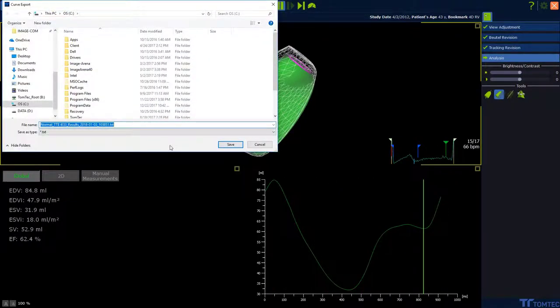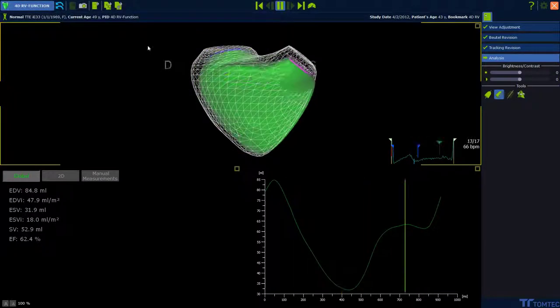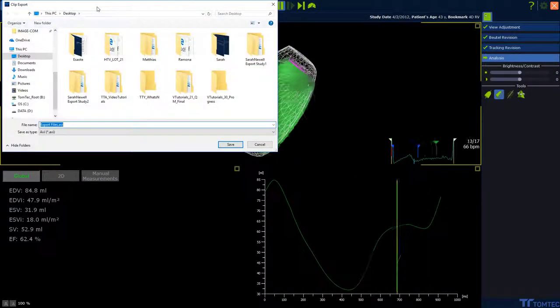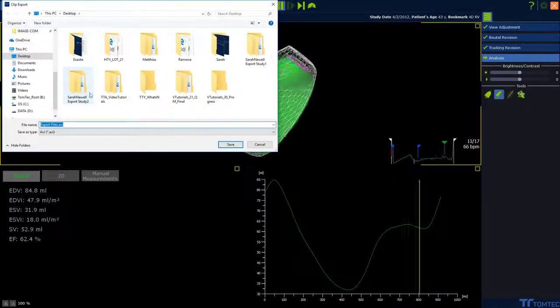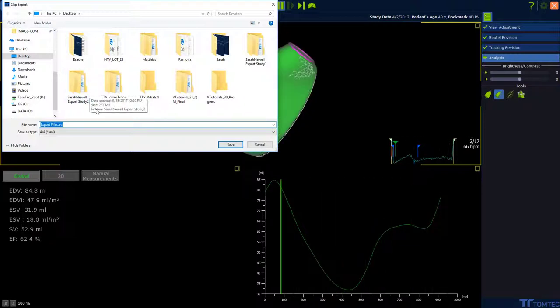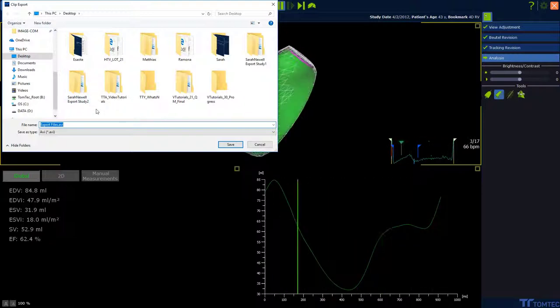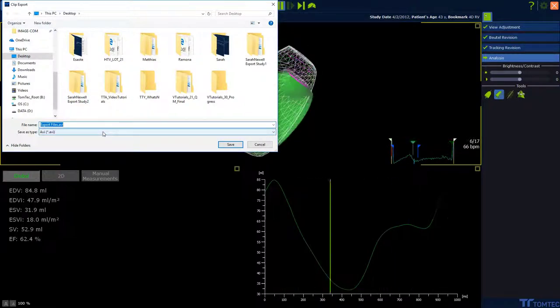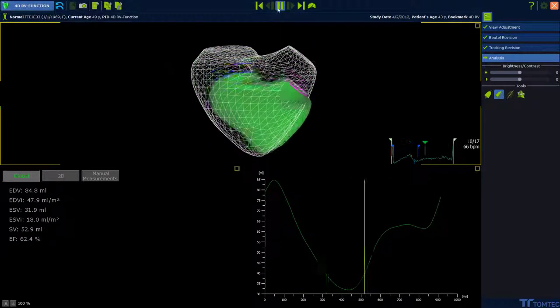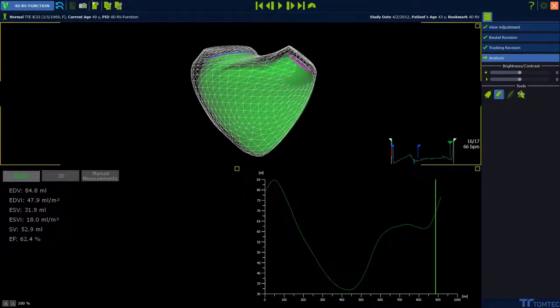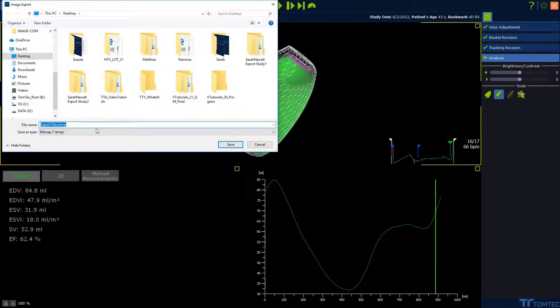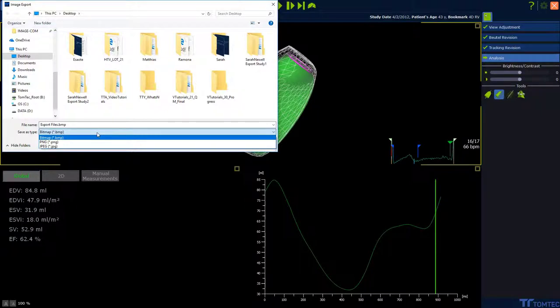The next icon gives us the opportunity to export, for example, an AVI. An AVI is produced if we have a running file behind. If we stop the loop and then press the button again, we get the possibility to export bitmap, PNG, or JPEG.